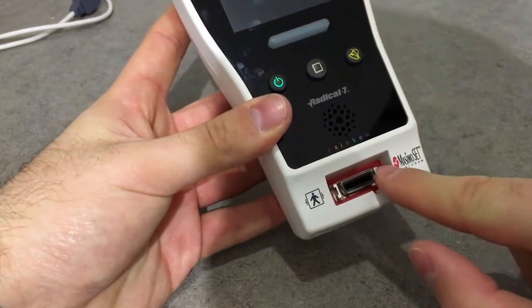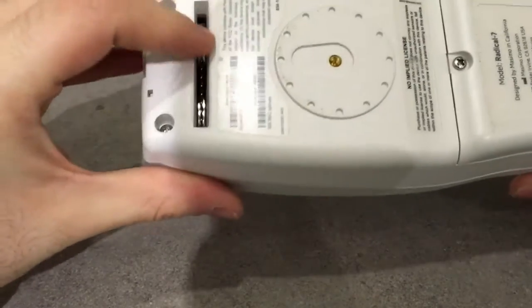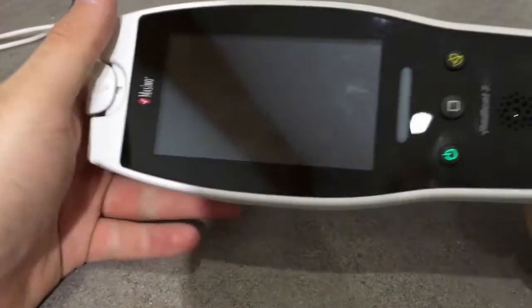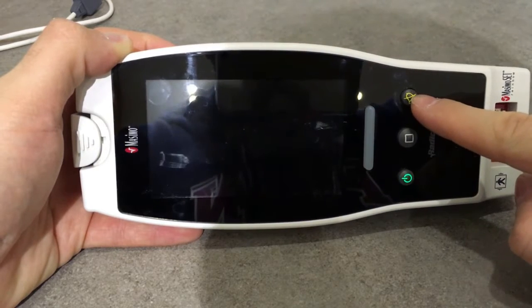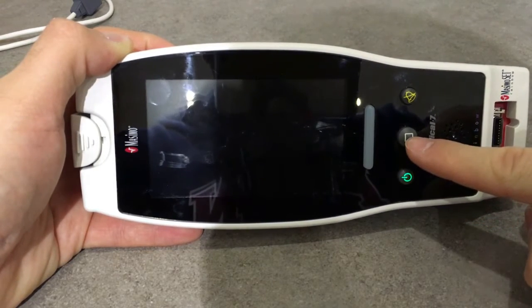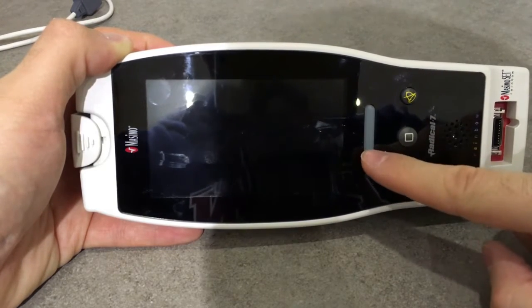As you can see here, we have the sensor connector. On the back we have another connector for the base or the Masimo Root. On the front we have four buttons: one to silence the alarm, one to turn it on and off, one to go back to the normal screen, and one to go into the profile settings menu.